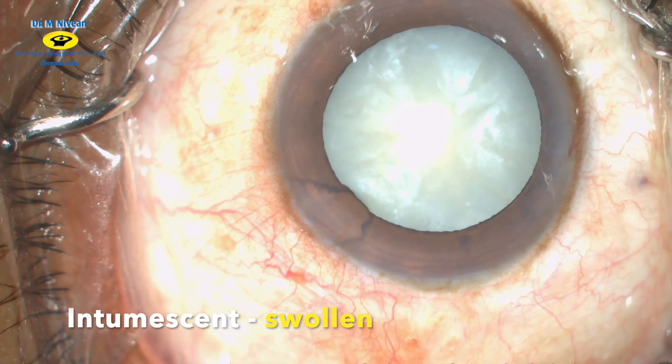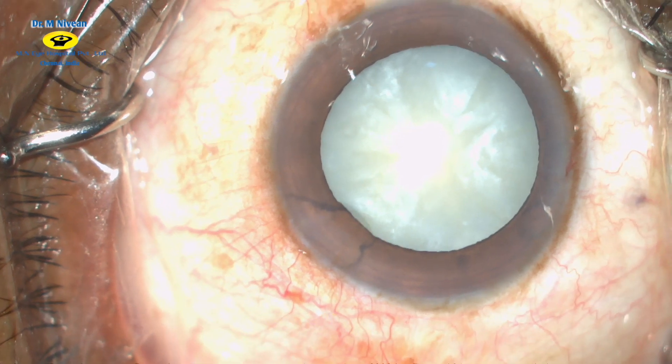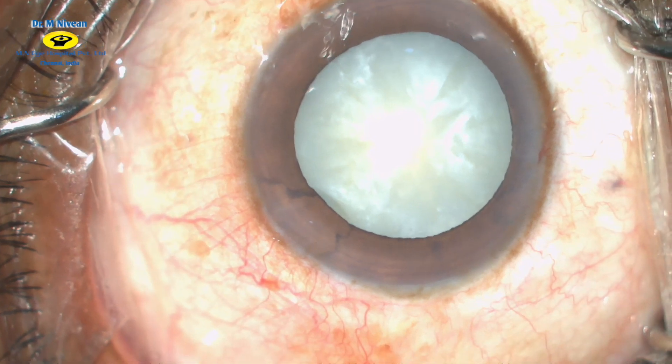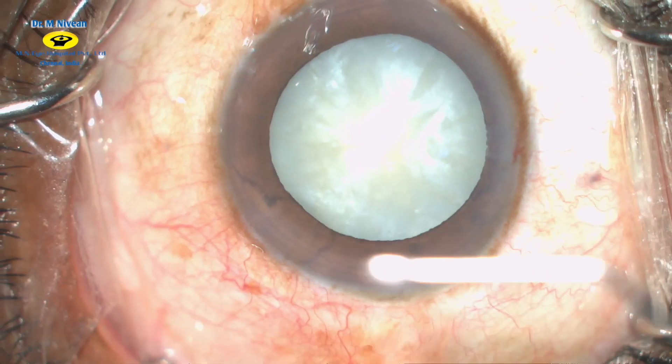This is the case of a mature intumescent cataract with increased intralenticular pressure. As you can see, there is bulging of the anterior capsule and pockets of fluid.